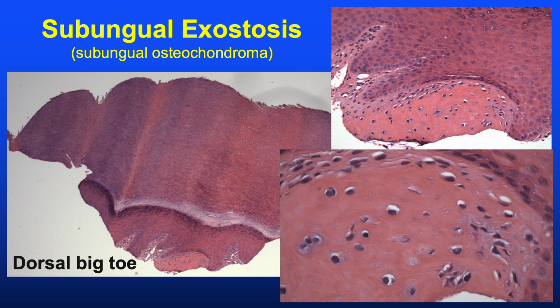In practice, probably the biggest clue to the diagnosis is simply the presence of eosinophilic compact bone in the superficial dermis on acral skin in the classic location. Associated calcification and cartilage may not be seen in a superficial sample.